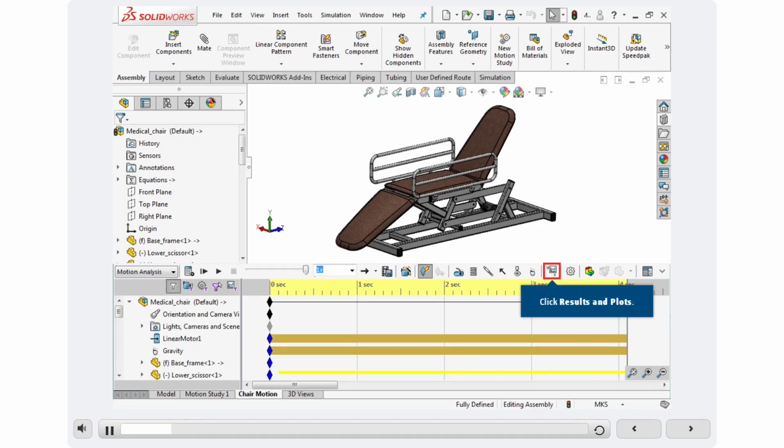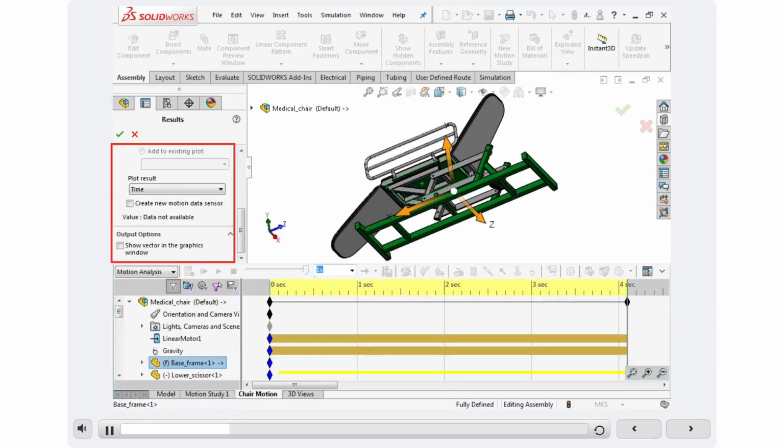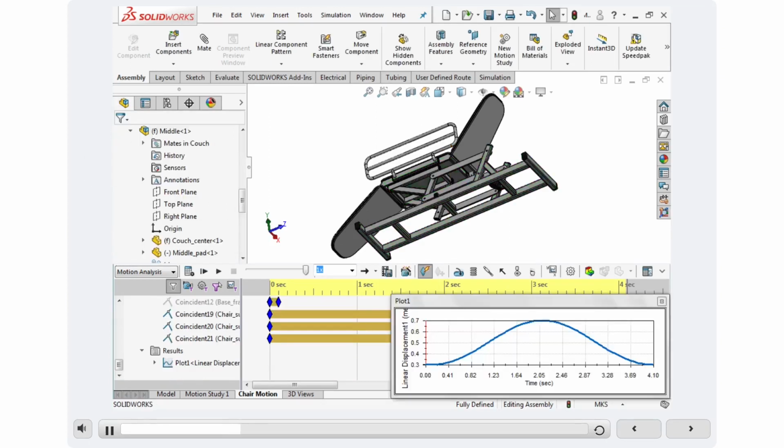Click Results and Plots. Define the plot by displacement, velocity, acceleration, linear displacement, and Y component. For Select 2 Points faces, click the bottom face of the couch center. For the component to define XYZ directions field, click the base frame and then scroll down. Retain the rest of the settings as they are and click OK. Then, rename the plot to Chair Y.